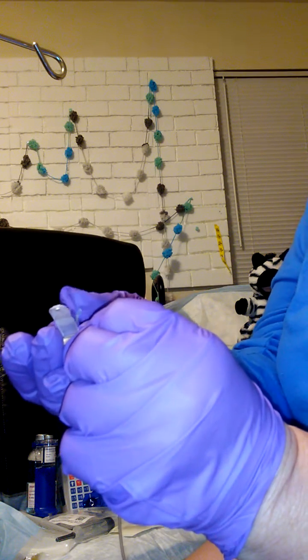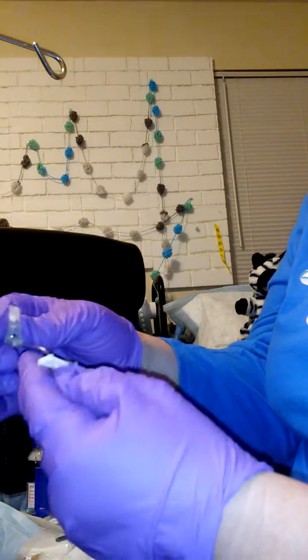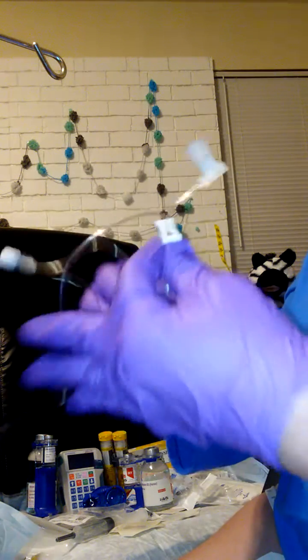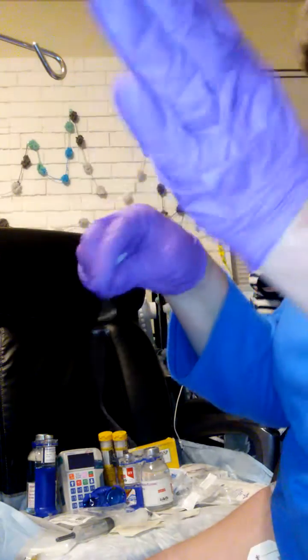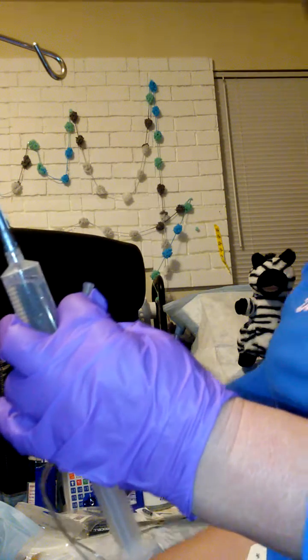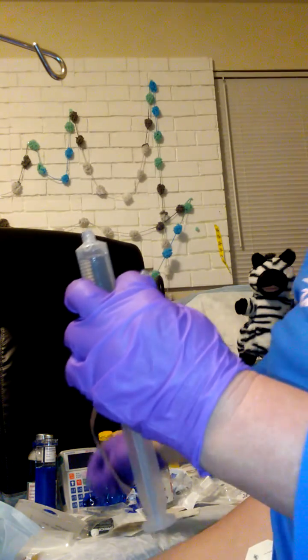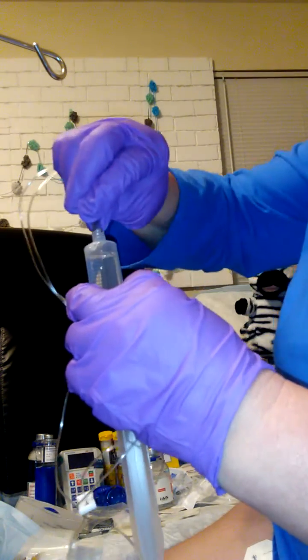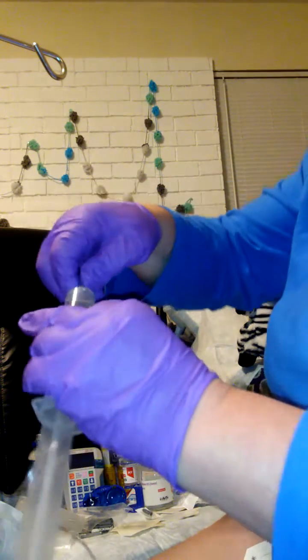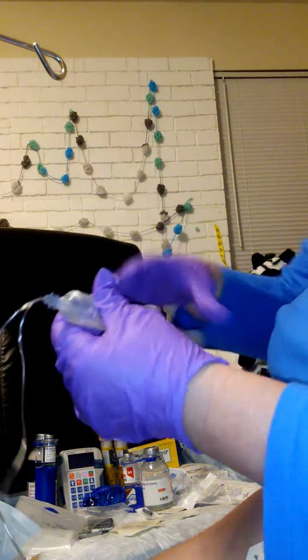Okay, so I'm going to put that little cover back on that, close this back up because it does have a little click that will close it back up. And these are locked. Both sides are locked, which means the medicine should not get to the end of the needle. So we're going to go ahead and hook this up to this baby. All right. This is a process. Yes, you can do it yourself. Don't panic. If you ever have to do your own infusion treatment, trust me, you can do it.